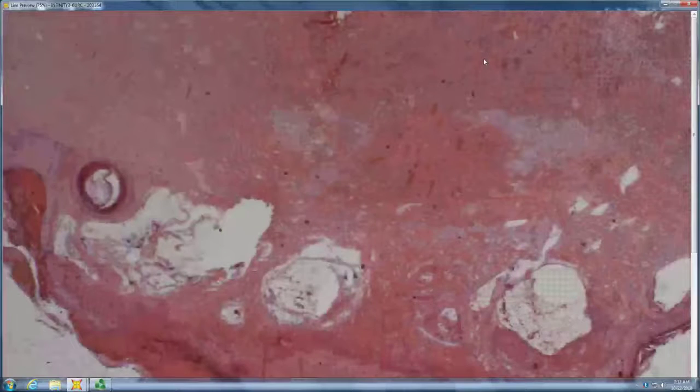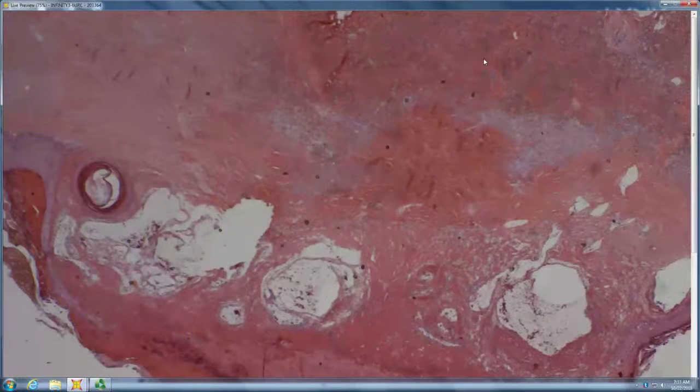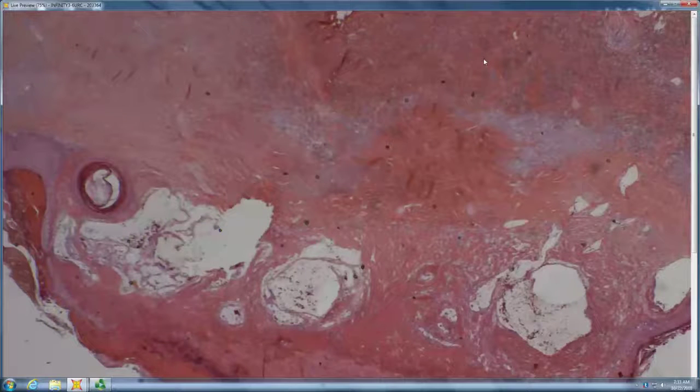And this is from the off-center of the mid-back, with a question of morphea. So what do you think about that? Do you think they were right? Was this morphea? No, probably more radiation dermatitis, right? And interestingly, the patient we just saw in clinic had been diagnosed as morphea, and the path had been read as morphea, but on review, probably not morphea, more like radiation.